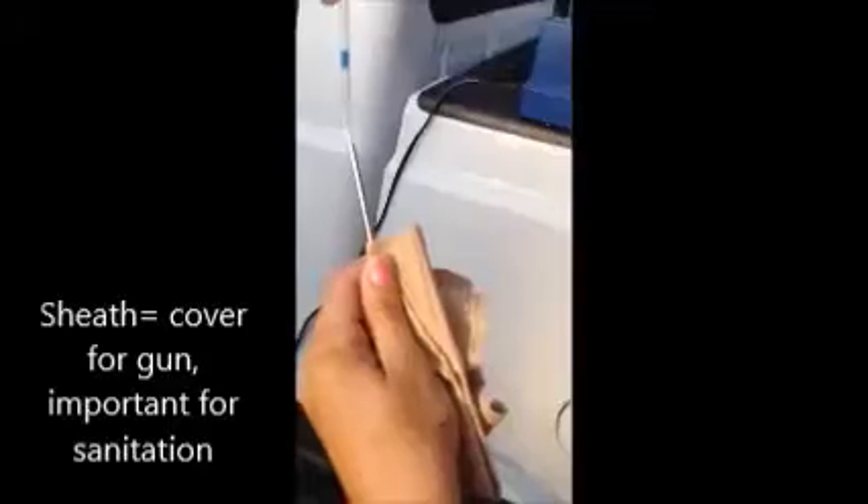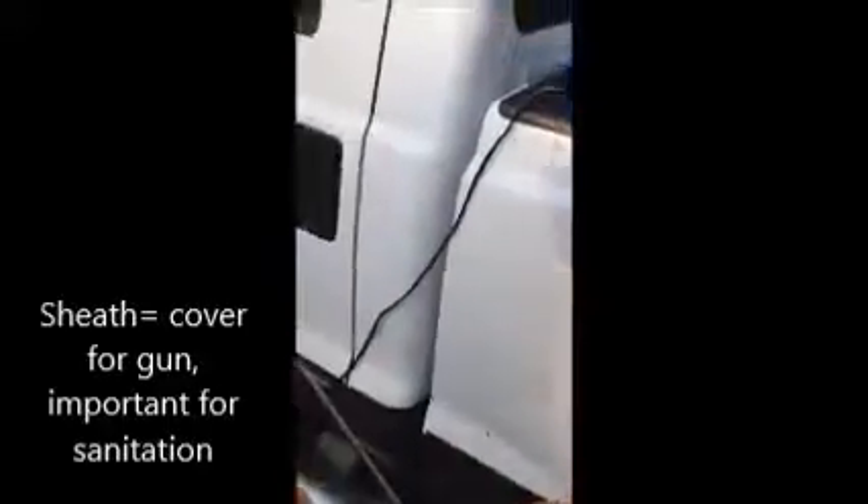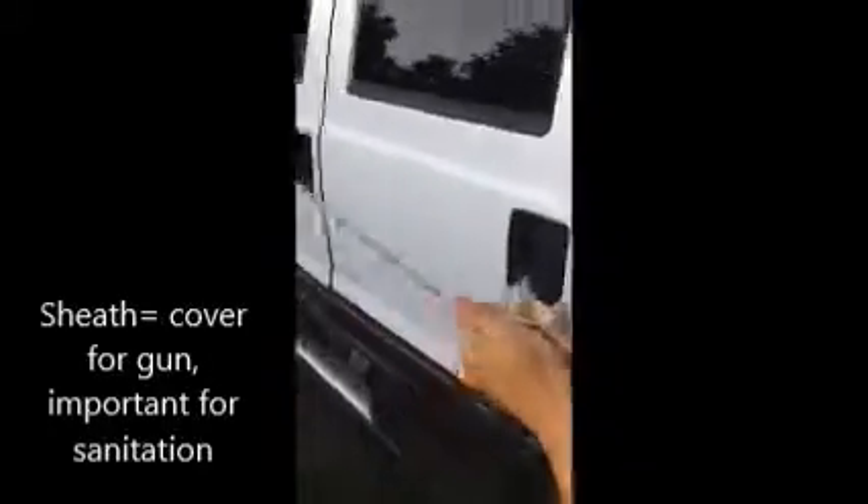So here's your straw of semen — we'll stick it in the gun and then cut off one side. Put your sheath on and stick it back in your shirt until you get to the cow.